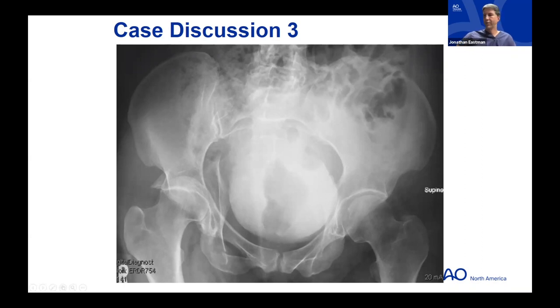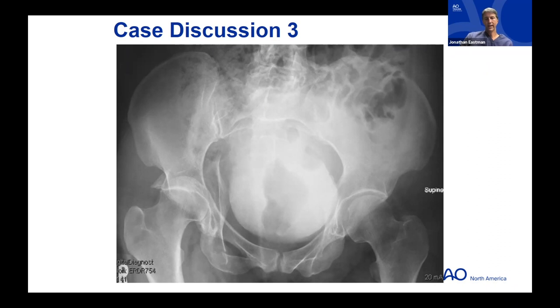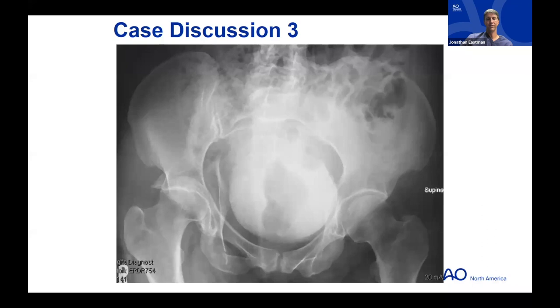Now for the third case — a younger patient, a 34-year-old female involved in a high-speed motor vehicle collision. Here's her injury AP pelvis — fairly good quality for a trauma bay film. There's a lot of contrast in her bladder, but you can see a pretty impressive right-sided injury. The faculty invite discussion on what participants are thinking.